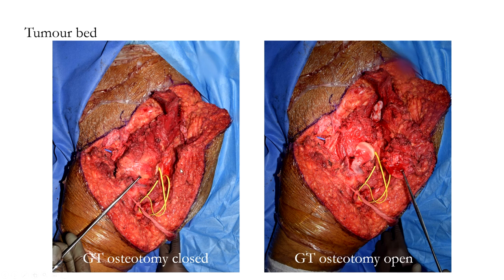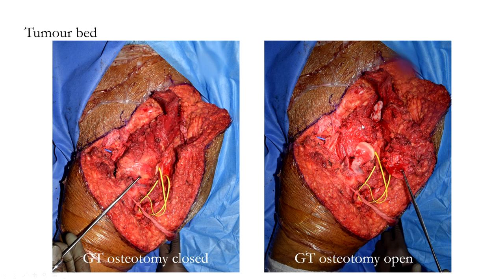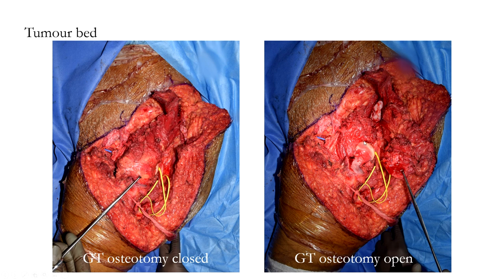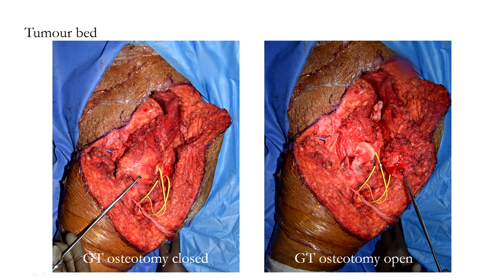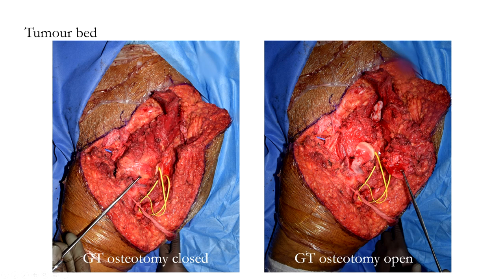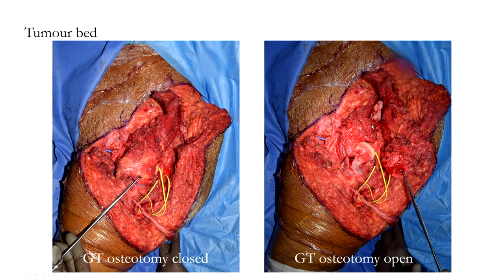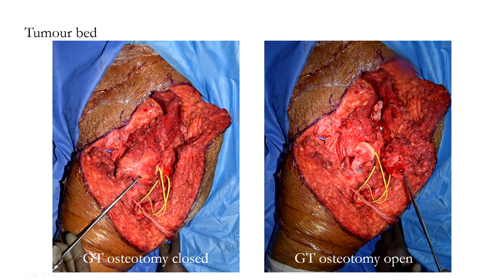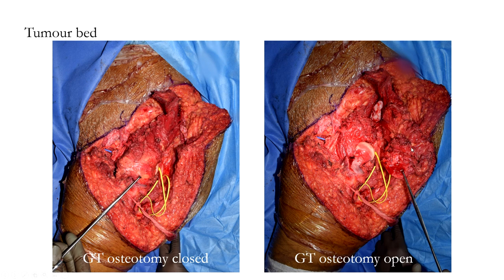Views are shown with the greater trochanter osteotomy closed and open. With the osteotomy open, the femoral head and the posterior sciatic nerve can be identified. All vessel branches exiting from the sciatic notch, including the muscular supply to the gluteus medius, were retained.